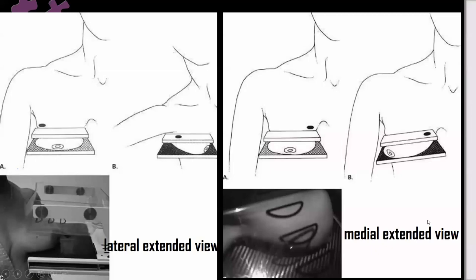this is the extended lateral, and this is the extended medial. This is a standard CC. Look here, extended lateral going where? This is the nipple. See the plate going more toward the lateral. And look for this spot where this is the X-ray. Going more lateral. While here, the plate is pulling forward the medial aspect, and the X-ray coming where? The center onto the medial aspect.